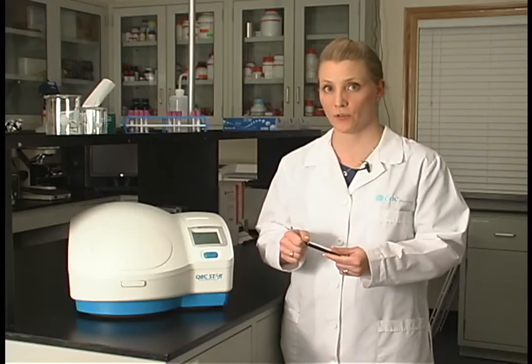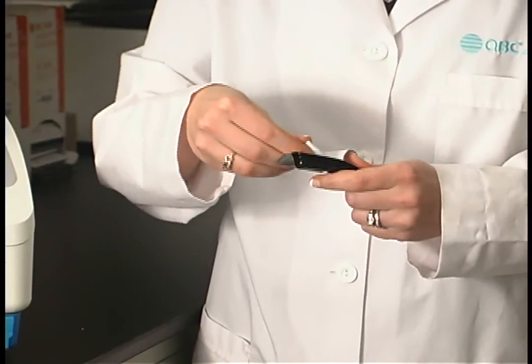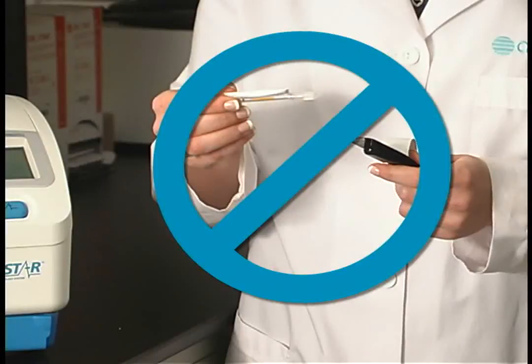If you open the tube by punching the tube through the white backing, or pushing down and pulling the tube out of the package, this will inadvertently seat the white stopper, ultimately preventing sample collection. This concludes the QBC STAR tube overview.